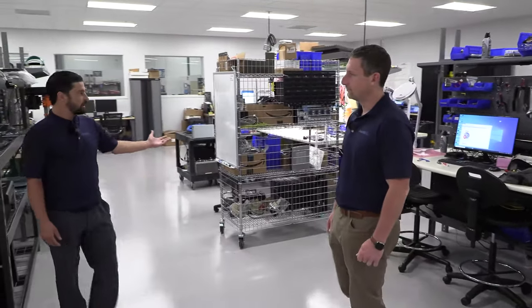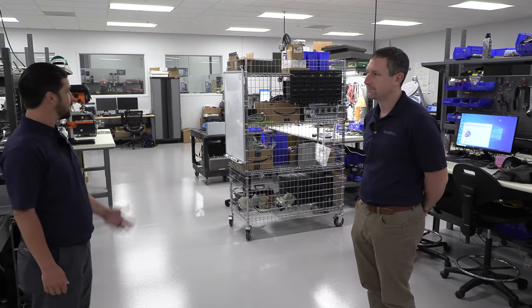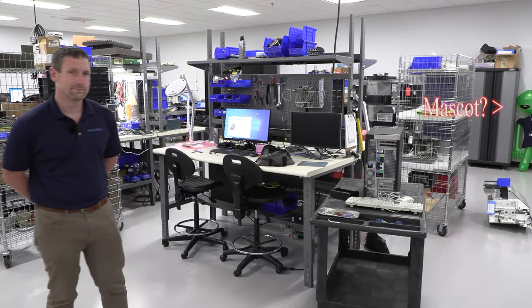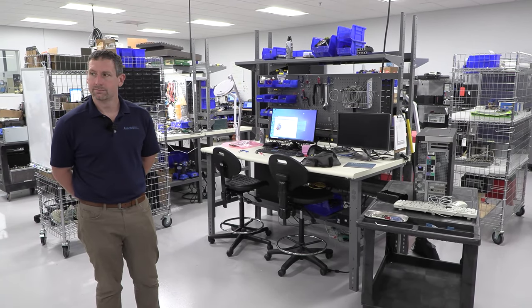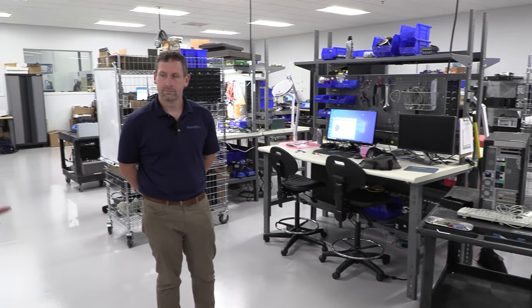So obviously these are our workbenches. Some of the engineers have their individual workbenches, and then we have benches that other engineers within the facility can come and use. They're all set up with soldering stations, proper tools that are needed, certain test jigs and stuff that are used for some of the parts repair. This is Kevin's desk. He does a lot of our PC repair for the PCs used in Philips Cath, Siemens CT, Siemens MRI. We do a lot of PC repair here.